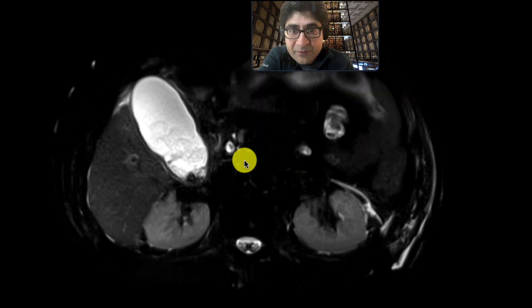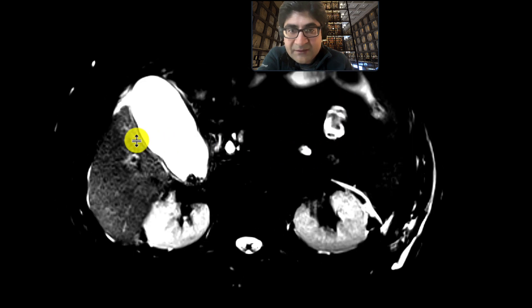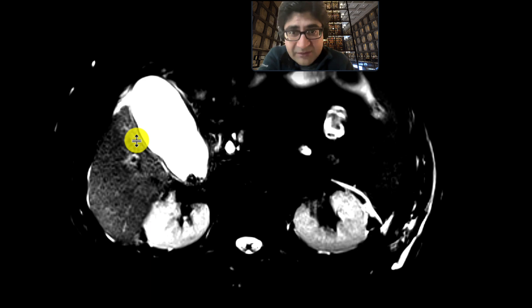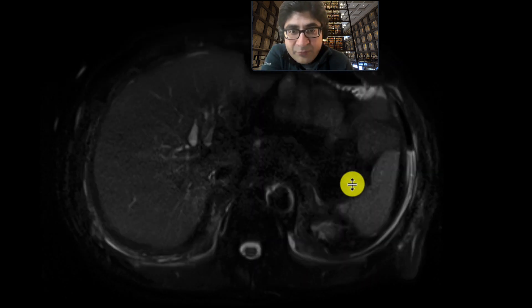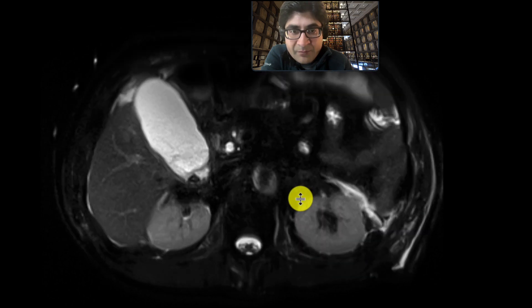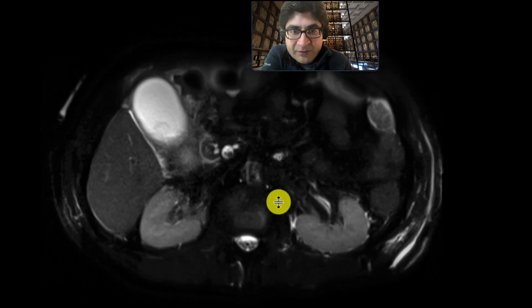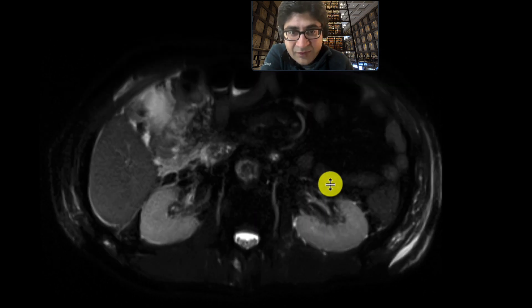If we look at the liver parenchyma adjacent to the gallbladder and window a little bit, we can see that there's a little bit of high T2 signal in that liver parenchyma, suggesting some reactive edema in that location. Windowing normally again, we can see that the biliary tree is a little bit dilated. Following the common bile duct, we can start to see these layering T2 hypointense fill-in defects within the distal common bile duct.